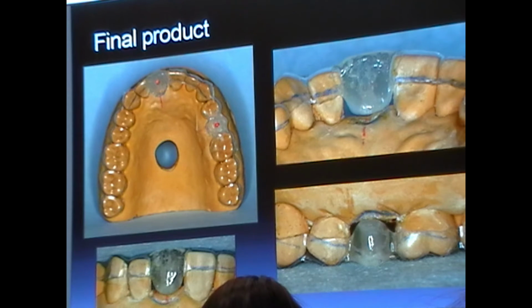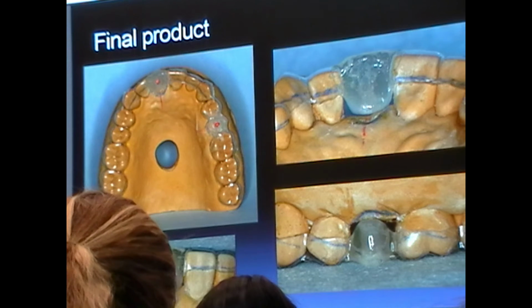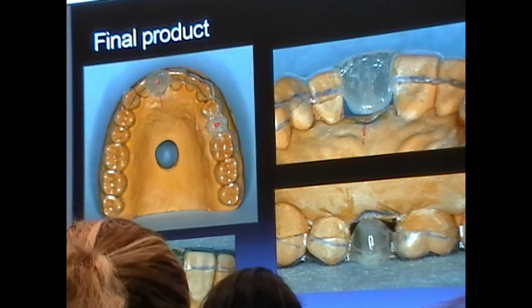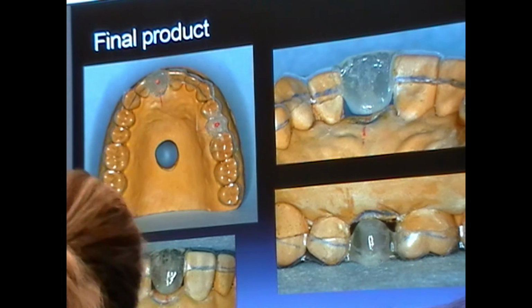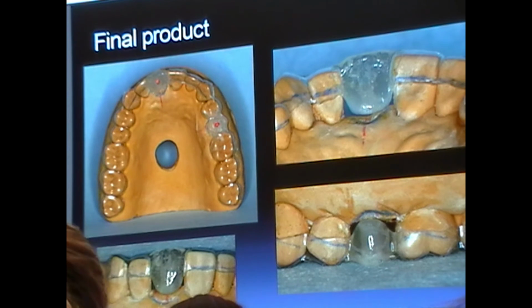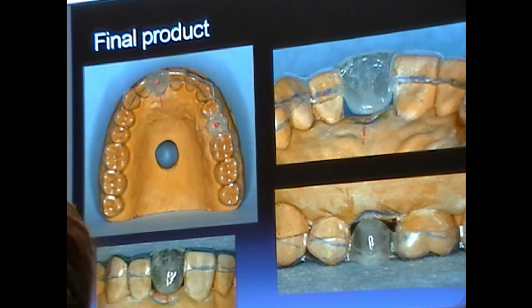What I want and need for you to most pay attention to is that once you trim this, you pay attention to the fact that you have relieved the gingival embrasures here, and that this is convex, right? But that you can still see just a little bit of space. If I look from a facial view, you can see just a little bit of space from that ridge on your cast. Maybe this shows it a little bit better. That's important.